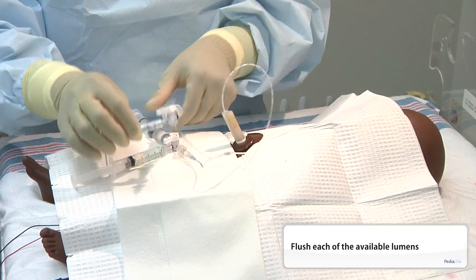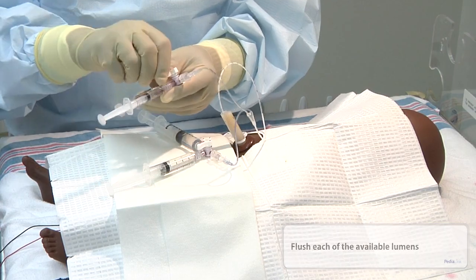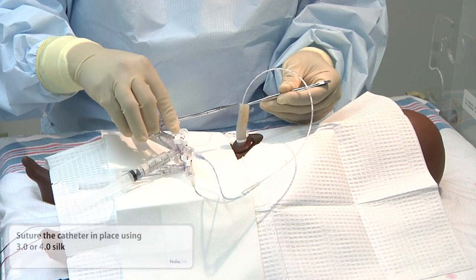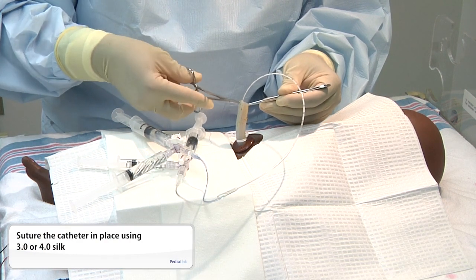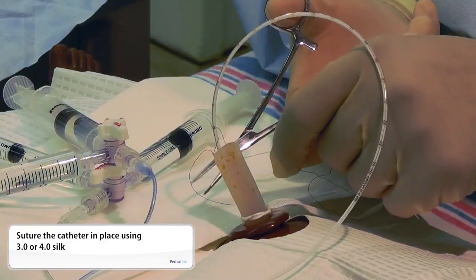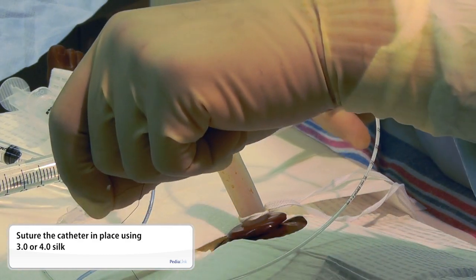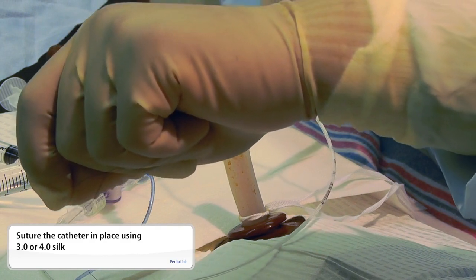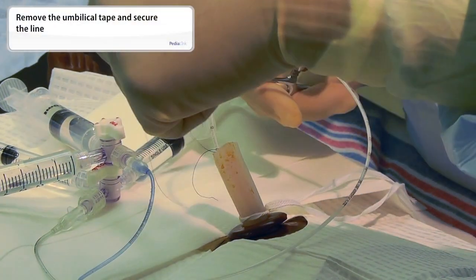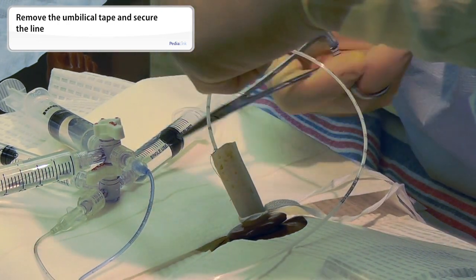Once you have inserted the catheter, flush each of the lumens with saline or heparinized saline. Next, obtain an X-ray to confirm proper placement. Finally, suture the catheter in place. You may elect to use a purse string suture around the cord. Then, wrap the suture around the line and secure with square knots just above the umbilical cord and at a distance 2 to 4 centimeters from the end of the cord. Finally, remove the umbilical tape and place a stabilizing dressing on the patient's skin.